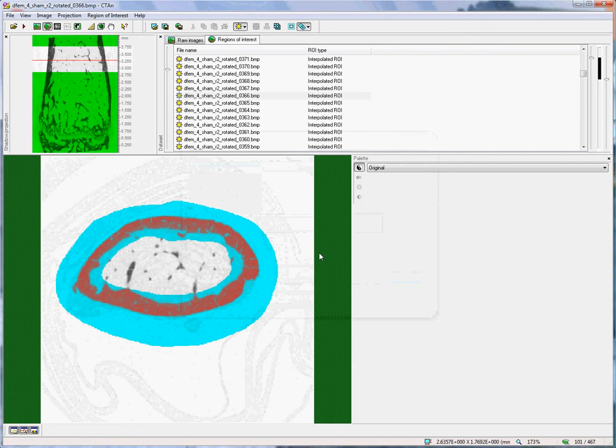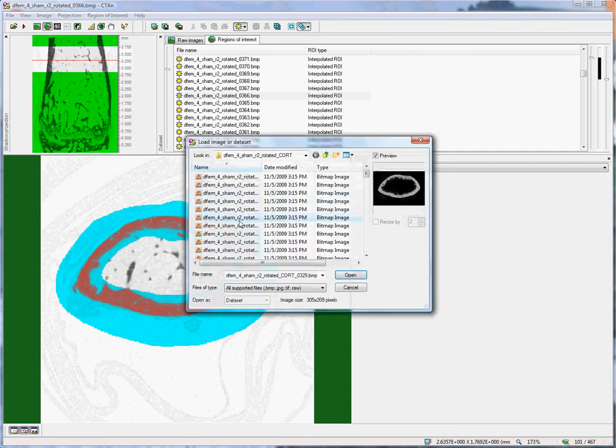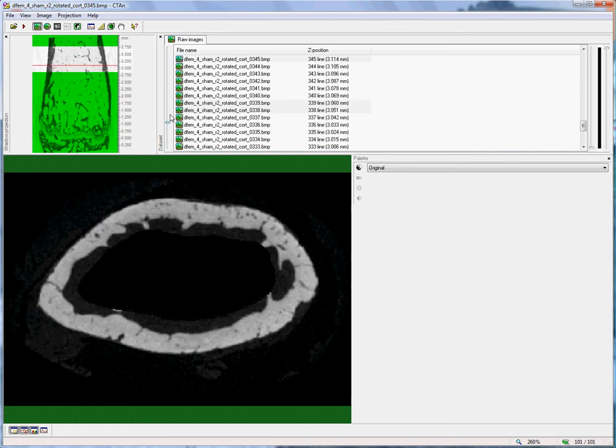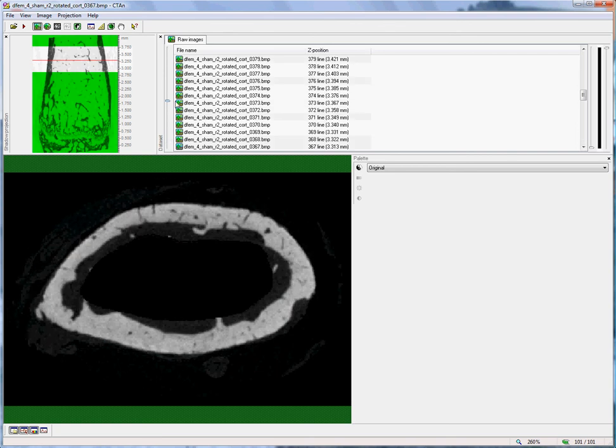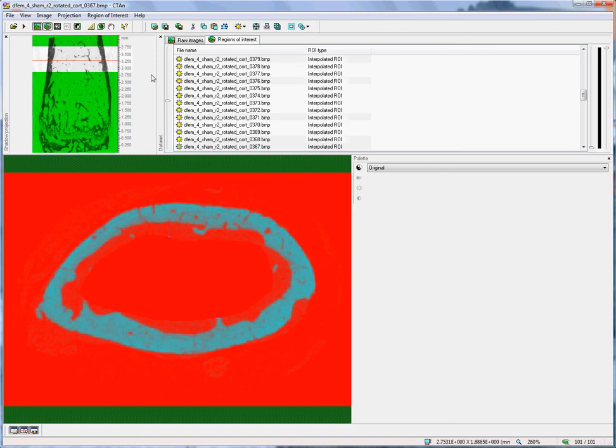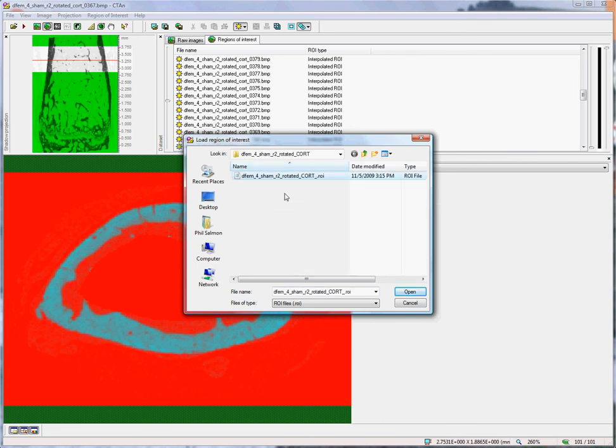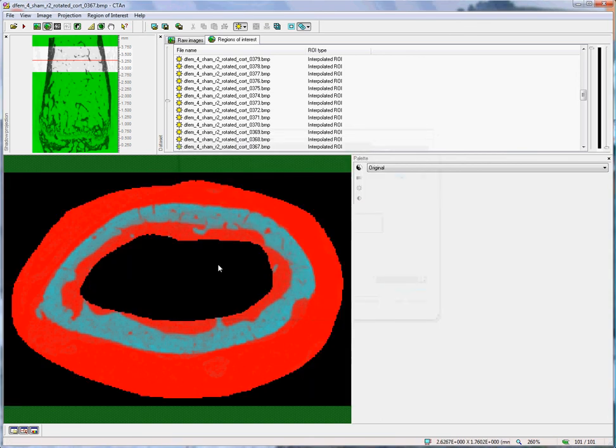It's very important to do the analysis from these reduced size VOI data sets, which makes analysis much more straightforward, because of the smaller volume of the data set. If I click Open, here is the ROI data set of the cortical bone. And to restore the ROI itself, go to the ROI page, and open a new version of the ROI file created within the ROI data set. Thank you.